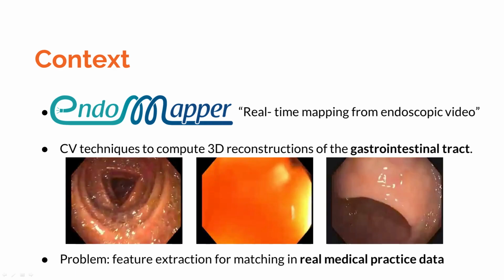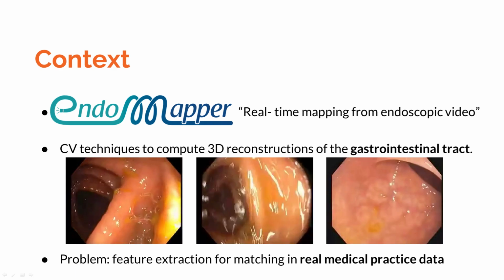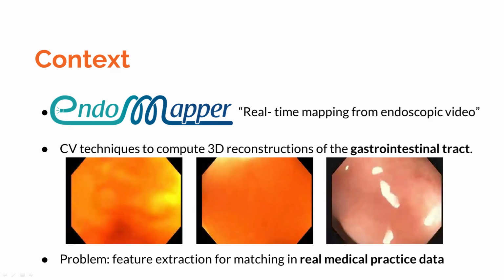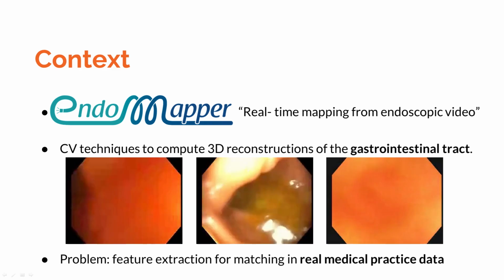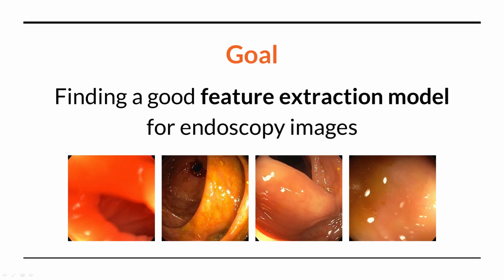This work was done inside the context of the ENDOMAPPER project, where our goal is summarized as real-time mapping from endoscopic video. We use computer vision techniques to create 3D reconstructions of the gastrointestinal tract. Here, we show some of the videos that were taken as secondary recordings, so the process was not modified for it. The problem we focus on in this work is feature extraction for matching in this real medical data.